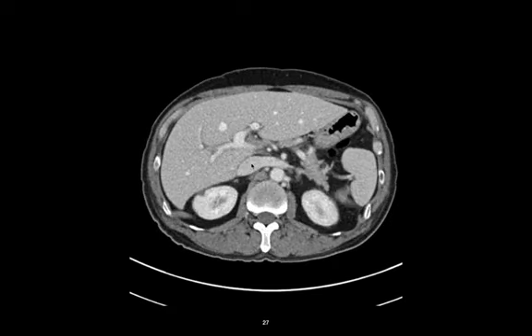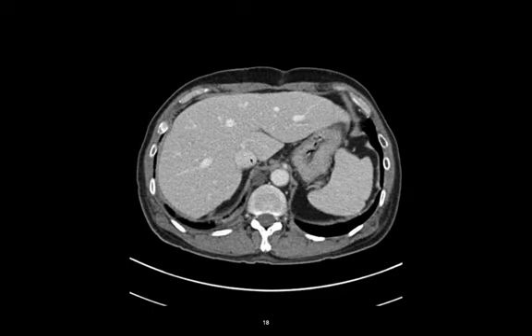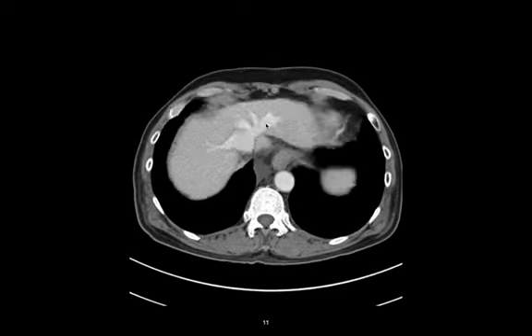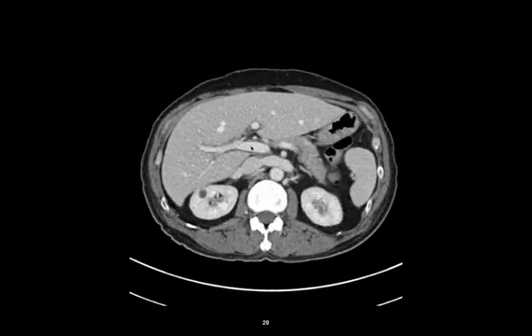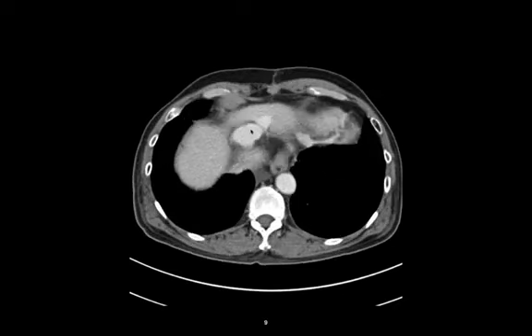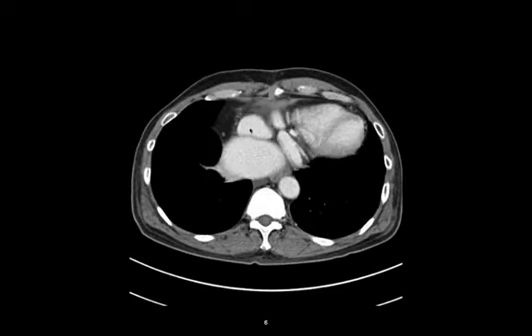Okay, now let's follow that inferior vena cava up. We're going up, inferior vena cava, and you see these veins coming and dumping into the IVC. These are hepatic veins that come into the IVC. So blood comes in through the portal vein from the gut tube into the hepatic sinusoids, only to then collect. You see all these veins collecting to go into the IVC just right here. And next, if we kept going up, we'd go into the right atrium.